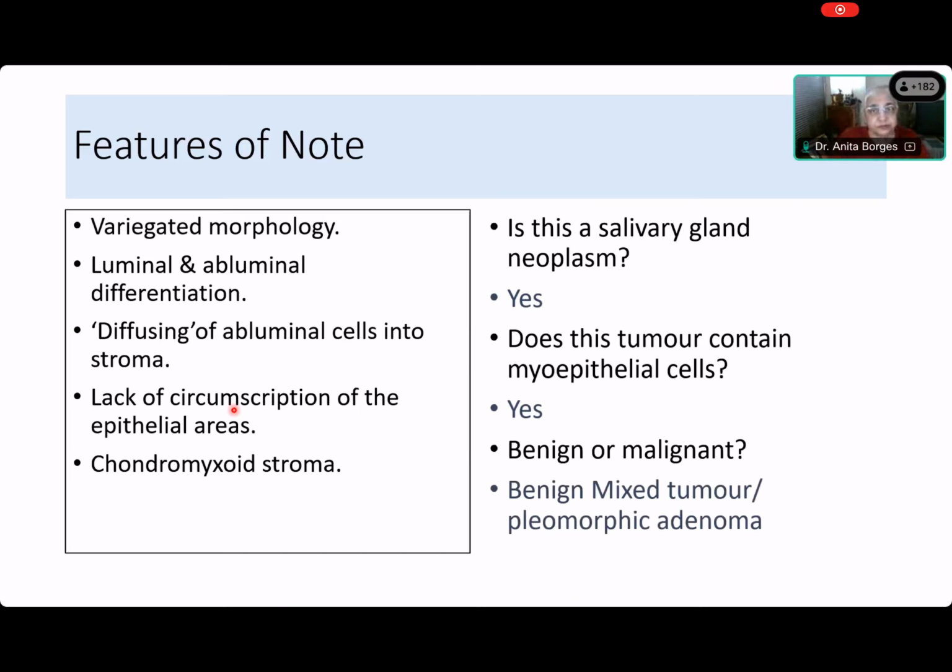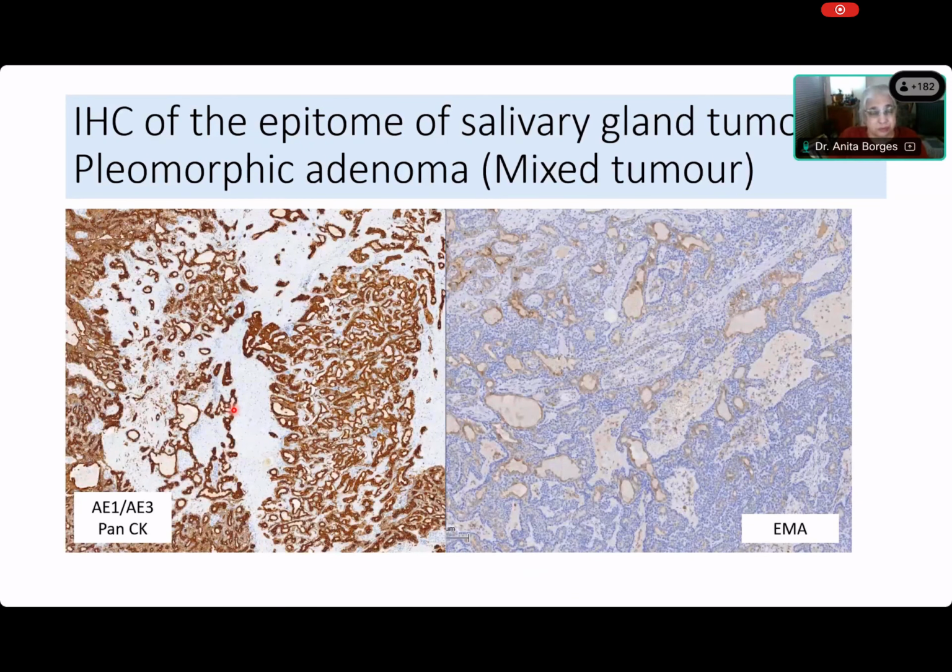All right. Good. Now, just to show you how the pleomorphic adenoma is the best example of how immunohistochemistry can be applied to a salivary gland tumor. You do not need immunohistochemistry. Shivani made the diagnosis at low power. So we don't need immunohistochemistry, but you can see how well it can be applied to a salivary gland tumor in here. You can see pan-CK.